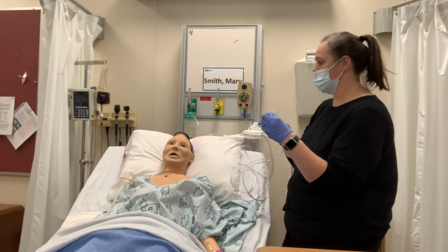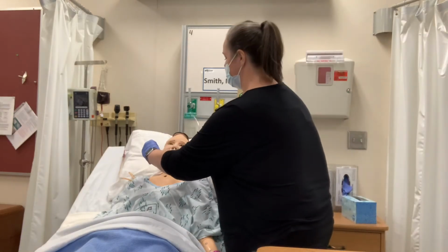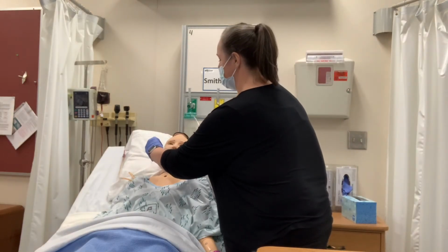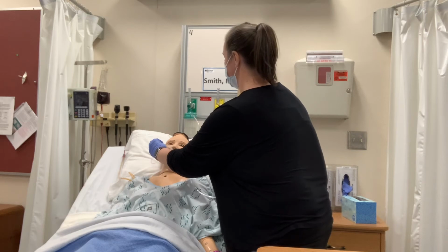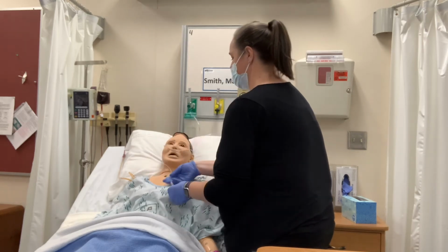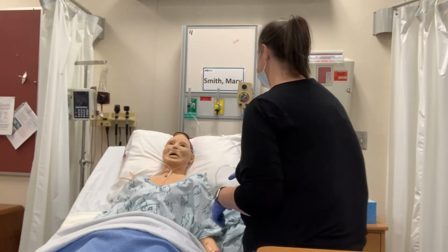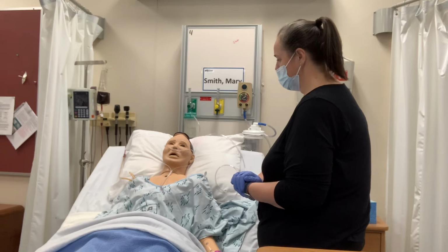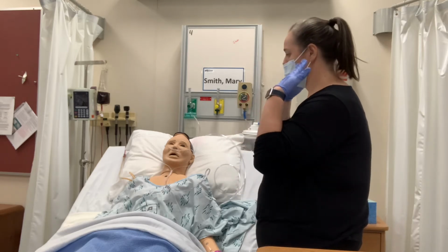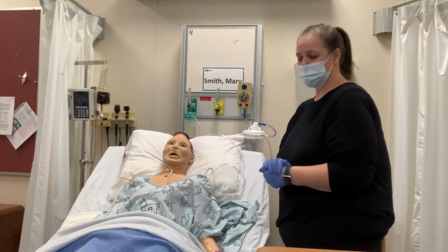So now I'm going to apply it onto my patient. Mary, I'm going to make sure these nasal prongs go down so that's not as irritating for your nose. And these are going to go inside each of your nostrils. I'm going to loop this tubing up around your ears and then lift this up so it's secure but not too tight. How does that feel, Mary? Does that feel comfortable enough? I can add some padding to your ears if you'd like. Okay, we'll just leave it like that.